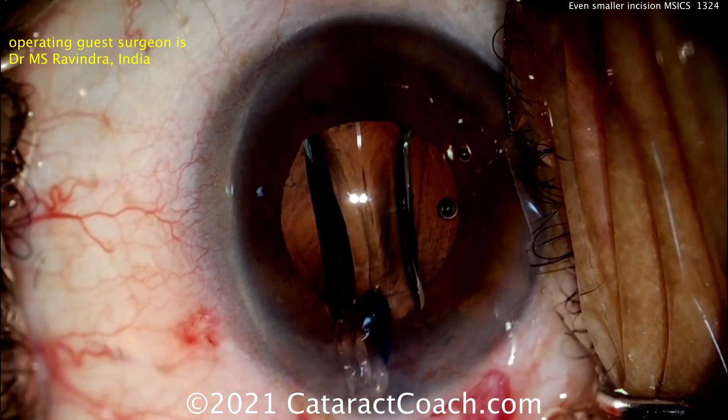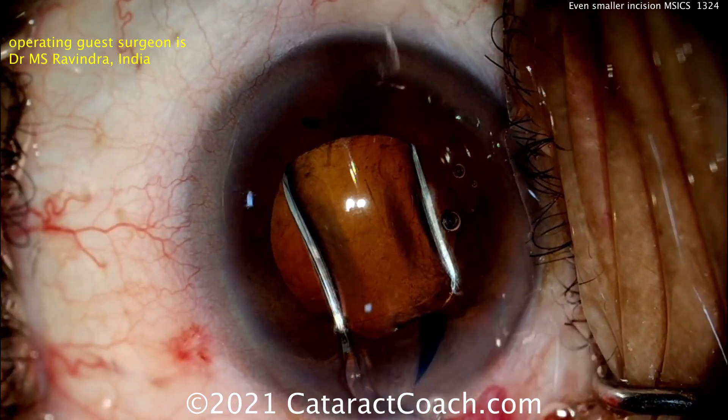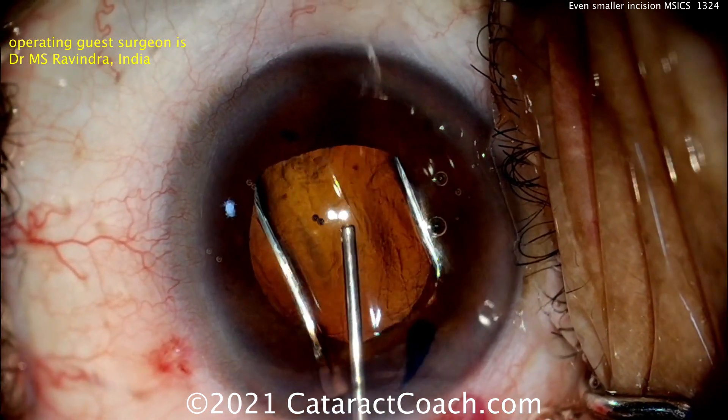IOL going inside the eye, right in the capsular bag. Looks like a single-piece acrylic lens. And that looks really good.